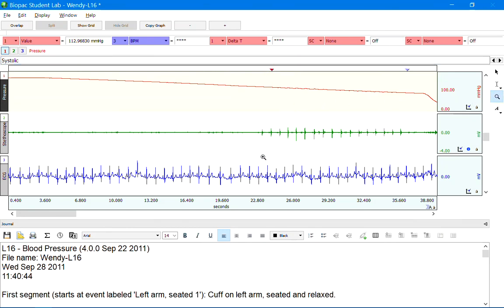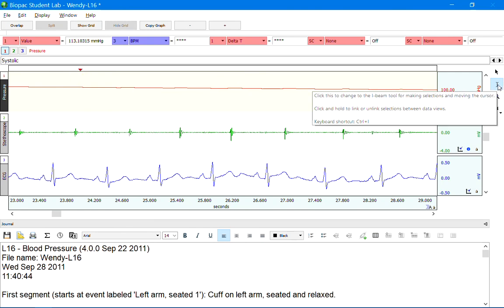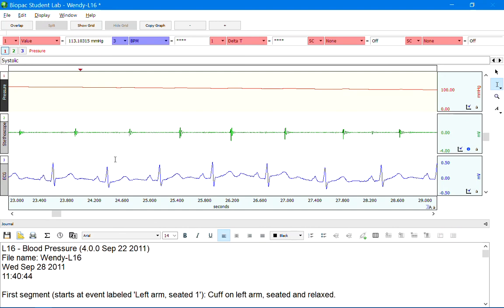So I want to zoom in on some of these waveforms here. So this would be when our systolic measurement occurred, and now we want to know our measurement of the Korotkoff sound. So as we first heard our sound here, we can take the following R wave, the next R wave that occurred, and we can now go to the very beginning of this first heart sound here.